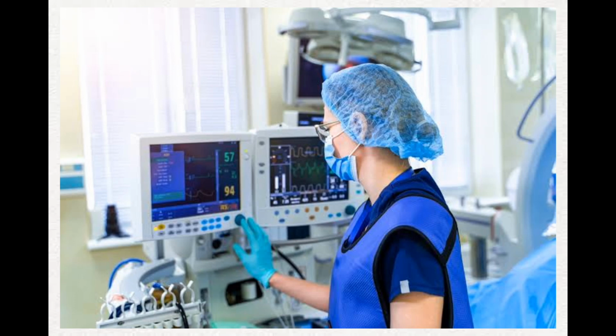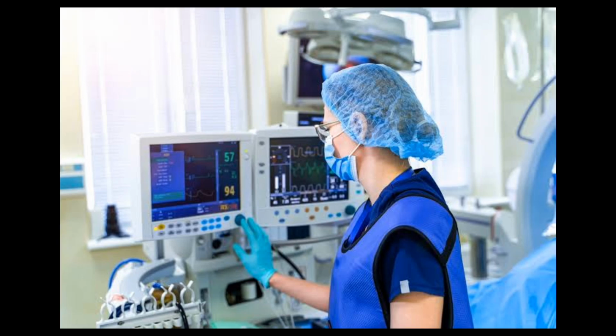Whenever you're using respiratory support devices, you are going to set the FiO2 based on the patient's requirements. If it's a patient that is very deficient of oxygen, you will need a high concentration of oxygen. That is, you are going to set the FiO2 on a very high level. And when the patient needs little oxygen, you are going to set the FiO2 on a low, minimal level.